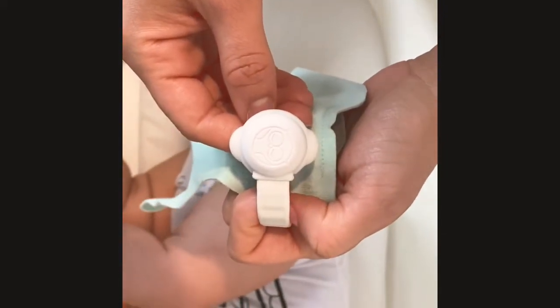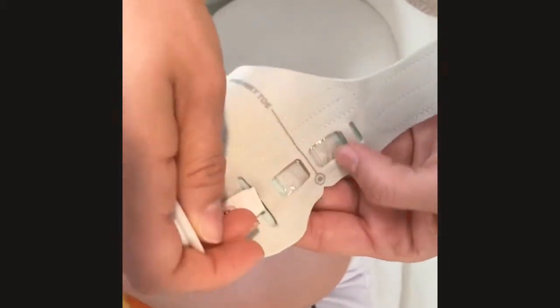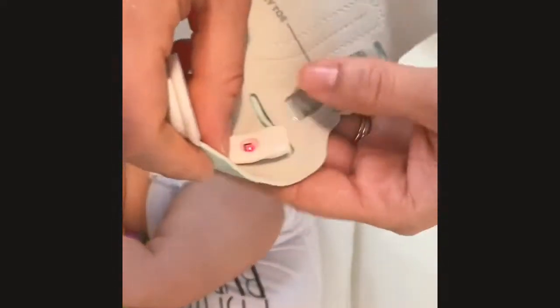Your actual device looks like this and it goes into a sock. They change sizes — they have three different sizes. He's in the last one, sock three, which is four to eighteen months.